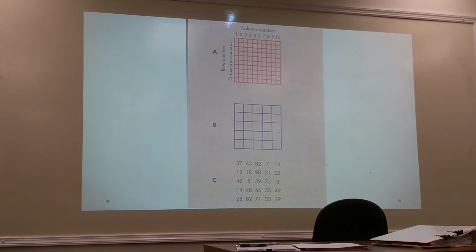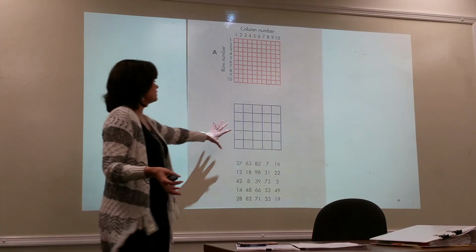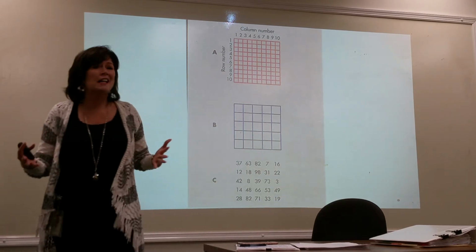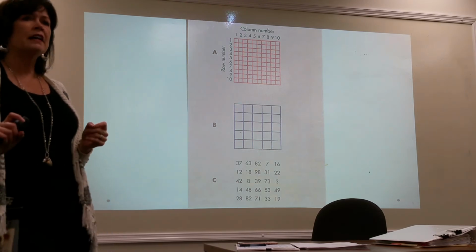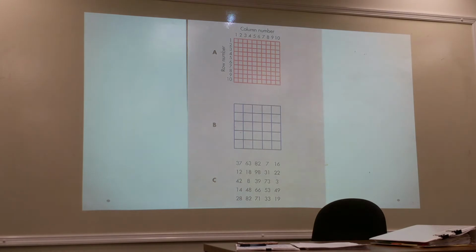So, pixel sizes. Now, let me tell you, the matrix, and sometimes we get confused with this, or maybe it was just me, the matrix does not change size. The detector that we have in this front room, which I think is a design defect, is 16 inches by 16 inches, a square. So what's wrong with that design? What are your cassette sizes that you use? 14 by 17.